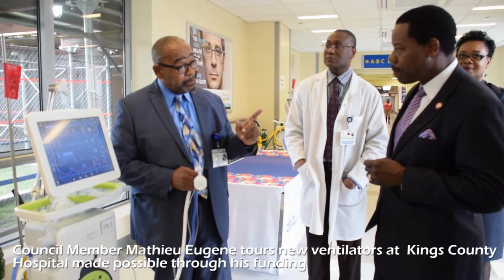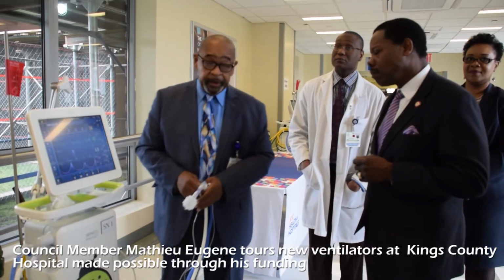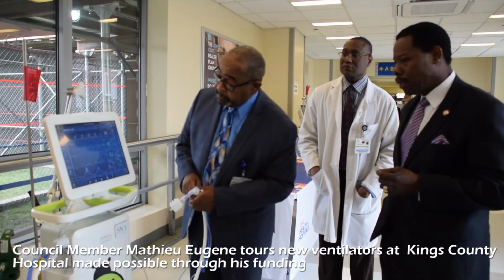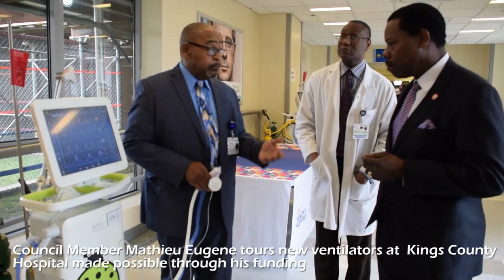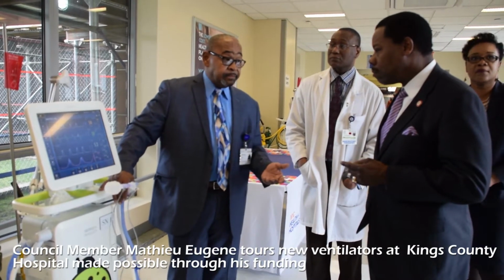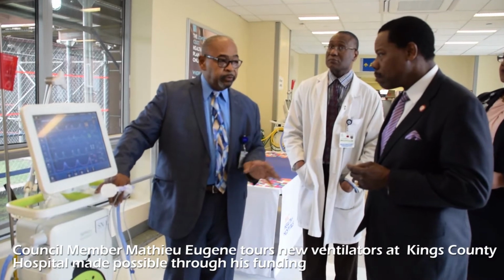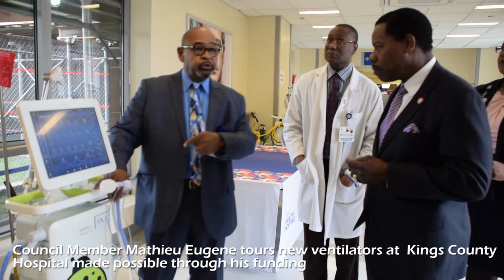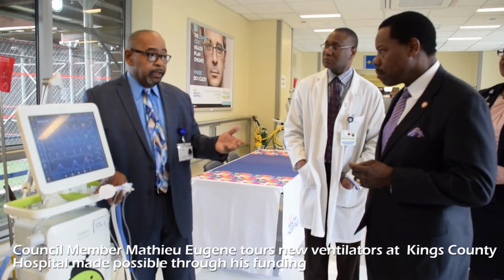Plus, if for some reason there's a loss of power, the machine will go into battery operation and continue to ventilate the baby. For how long? It depends. That depends on how many batteries you have. The machine can accommodate as many as 6 batteries. So if you have 6 batteries, then it can actually ventilate the baby for 300 minutes. Okay, they come with 2. Usually with 2, if the machine's plugged in and the battery's fully charged, you probably get about 75 minutes out. And since they don't use these machines to transport babies within the hospital, it's not of any consequence.